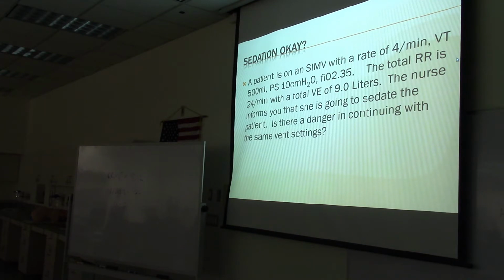The nurse informs you that she is going to sedate the patient. Is there a danger in continuing with the same vent settings? Well, what sedation should she give? Heavy propofol. Okay. So there is a danger.